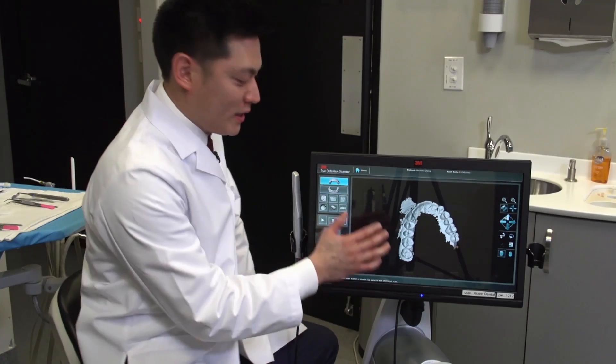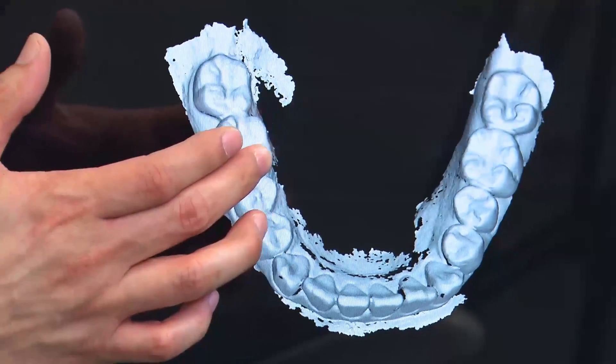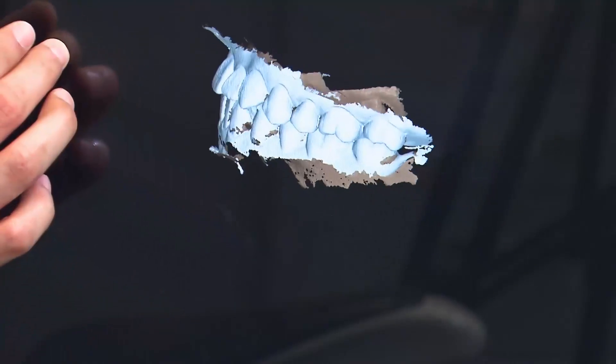We now have our completed scans — this is our maxillary arch and the mandibular arch to establish the opposing. We've also captured the bite registration and how the two arches relate to each other. The next step is to complete the prescription.